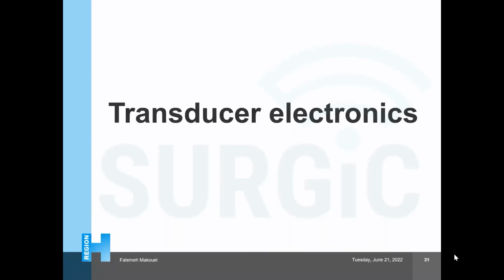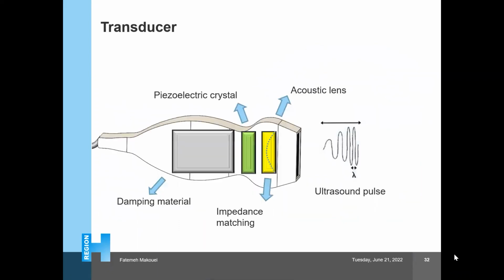Finally, we will check out the transducer structure very briefly. This schematic shows the main structure in construction of the working end of the transducer. The waves are generated by the piezoelectric crystals. So how do we generate a sound wave? We take a piezoelectric crystal, put it in the probe, and then apply an electrical charge to it, which causes a mechanical pressure on it. That causes these crystals to vibrate, and then they mechanically create a sound wave.